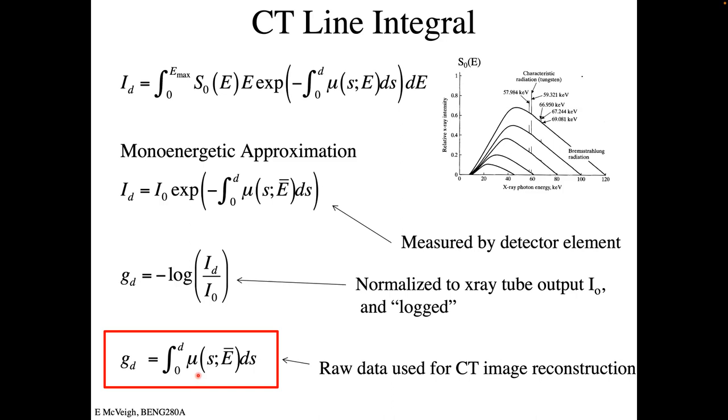When you get data off the CT machine in pure raw format, it's usually a set of essentially shadowgrams. They're shadows. So what you do is divide by the intensity of the X-ray tube for each point, and take the log and multiply by a negative, because this is between 0 and 1, and then you get a positive number. That positive number is the data we're going to use to reconstruct our picture, and it's called the logged data. All of these numbers are positive, and they're all real numbers. They don't have phase or anything like that. We haven't measured any kind of phase shift.